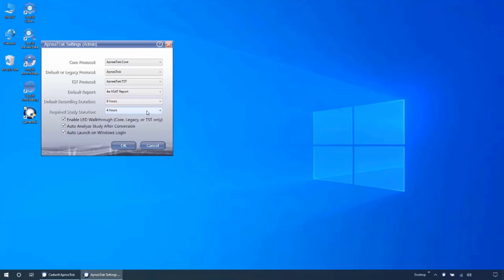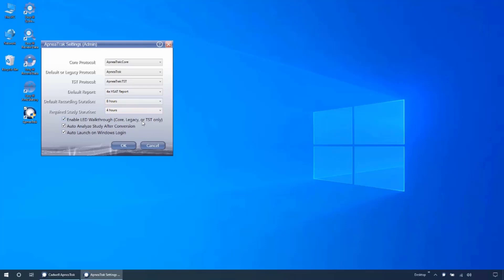Required study duration will determine when the data integrity report will flag a record as having too little data. Enable LED walkthrough will determine if the device will conduct a signal check when held for three seconds or more.